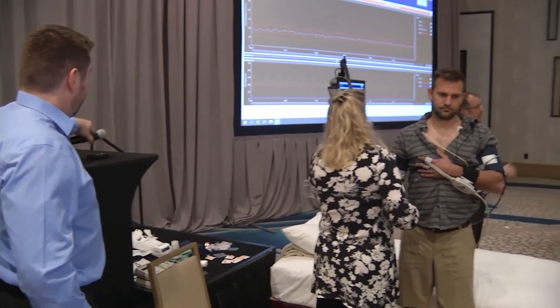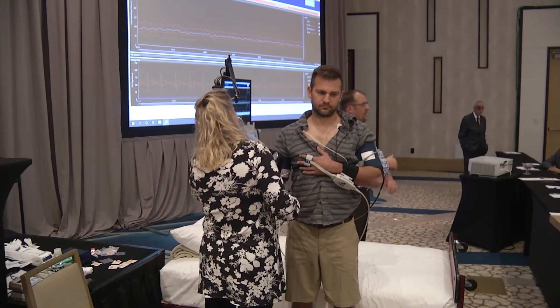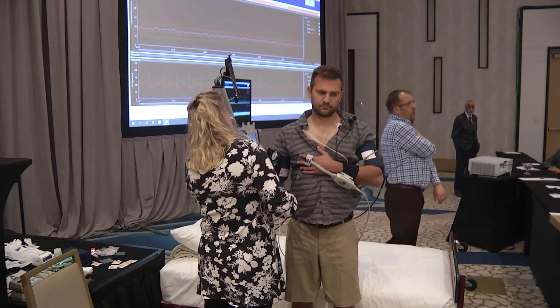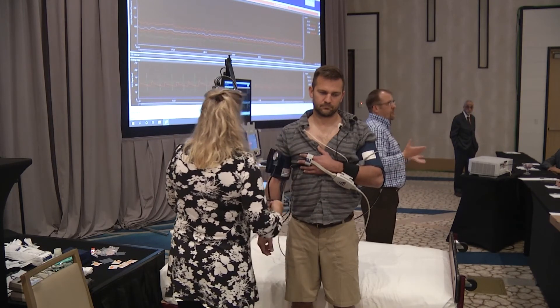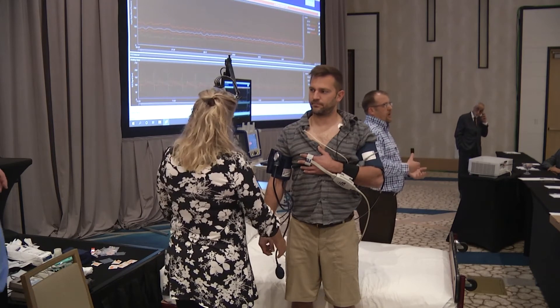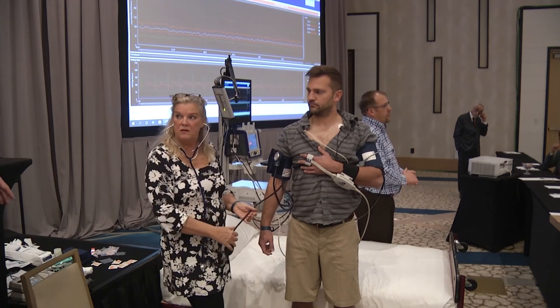It really depends — sometimes it reads low, sometimes high. We don't always use the upper arm cuff calibration with our devices; we just put it on and go, then adjust for height and temperature. It really depends on your setup and how you're doing things.